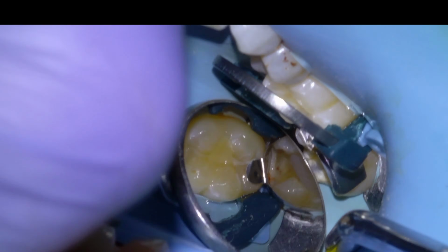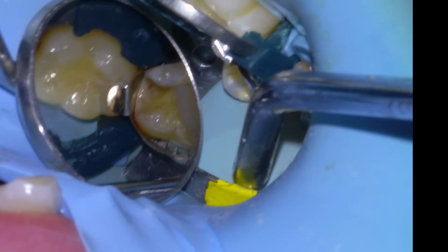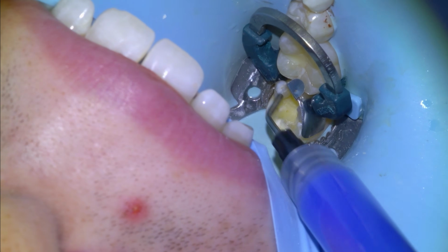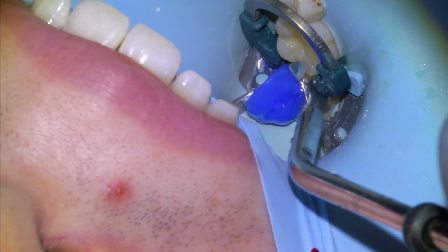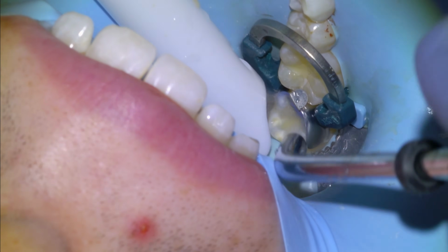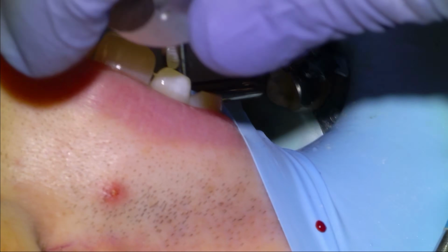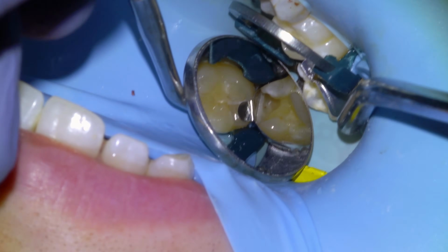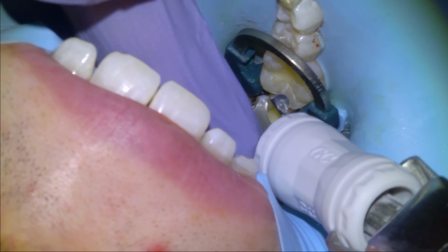So that's ready to go there. We're going to etch it. And my protocol for restoring teeth with glass hybrids is a 5-second phosphoric acid etch, followed by a thorough rinse, and then mostly drying the tooth. I have read a bunch of papers that say that this is an effective method for bonding both glass hybrids and resin modified glass ionomers.